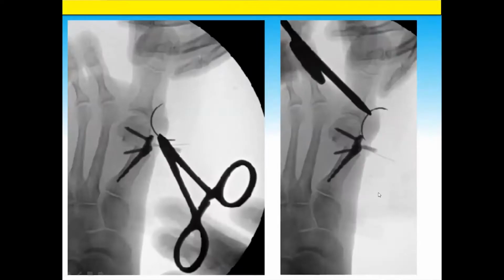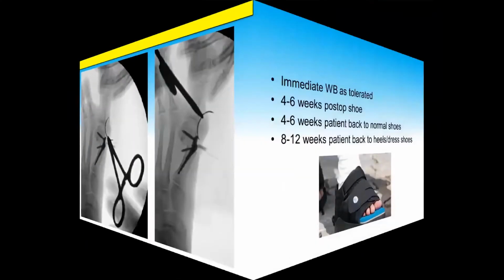You can see that done here, through the incision out distal, and then through the incision distal back proximal, basically like a percutaneous Achilles repair type of concept. And then this is held to the plate so you can get it well anchored, because as you know, usually the capsule proximally is not very stout to be able to close that to correct that transverse plane soft tissue.